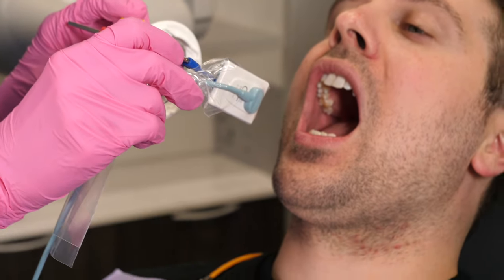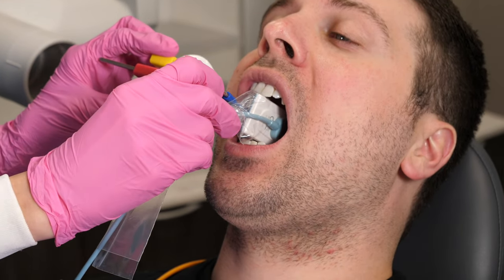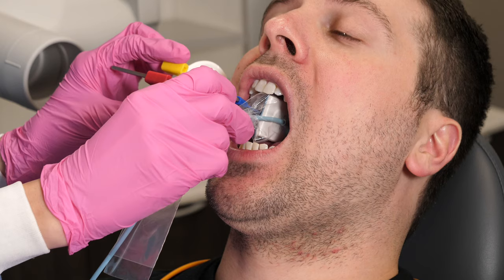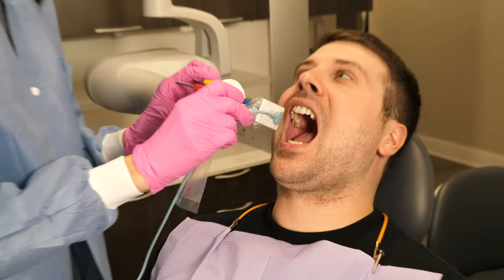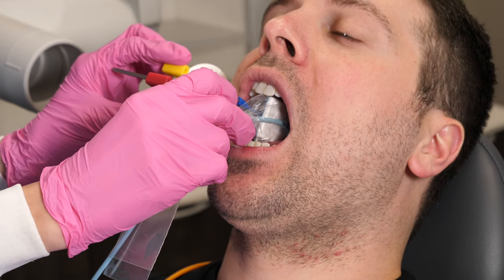The first tip that always helps me with all x-rays in general, whether they are bite wings or PAs, is keeping the sensor in the middle of the patient's mouth. You don't want it right next to their teeth — you want it sitting right in the midline. Of course, this can be hard if there's a prominent palatal torus, but do the best you can for the sensor to be as close to the middle as possible.